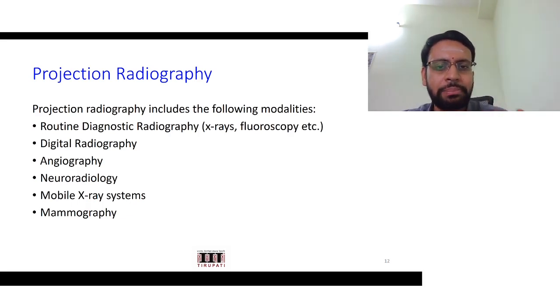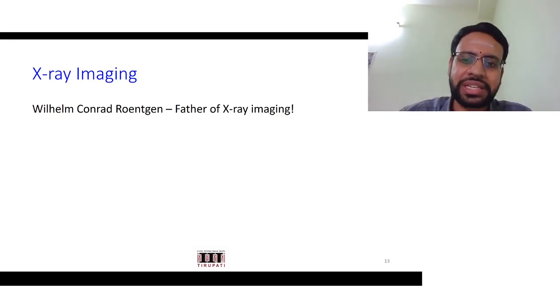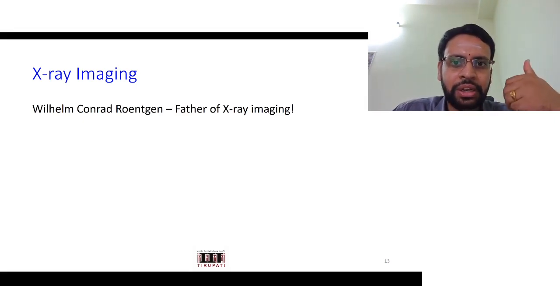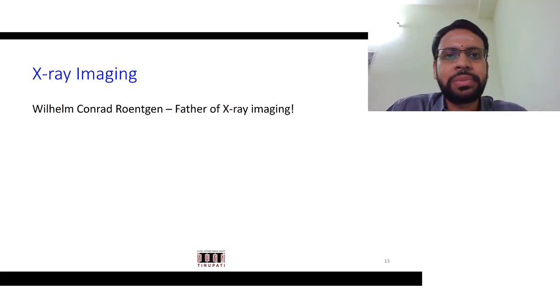We will anyway come back to some of these modalities later in the latter part of our course. And with that, this is what I am referring to as X-ray imaging. So all of them are X-rays. Although the latter, computed tomography, is also another classification of X-rays, that 3D one is usually referred to separately rather than calling it simply X-ray imaging.